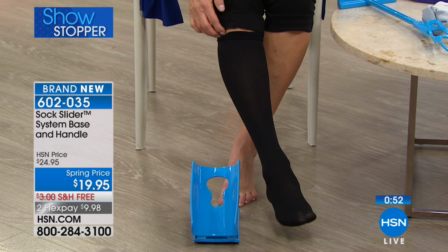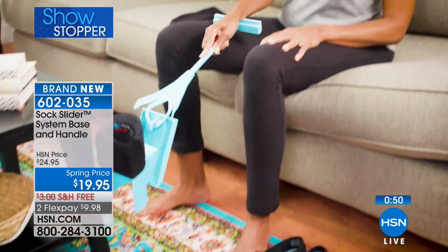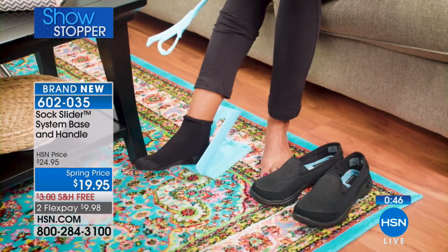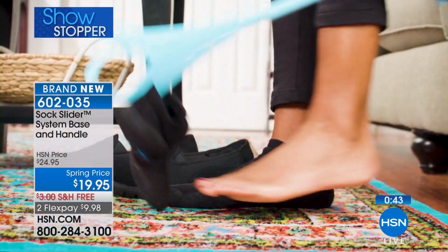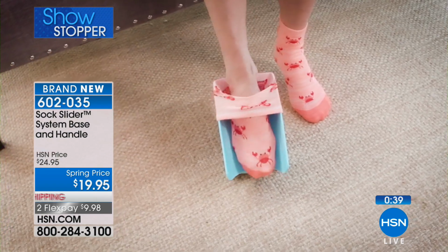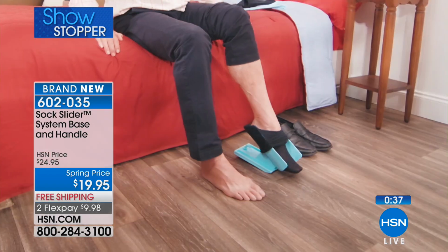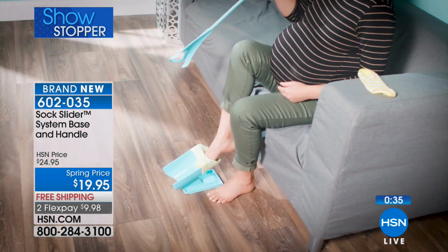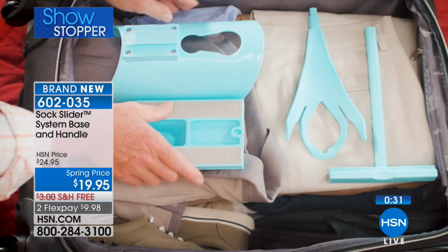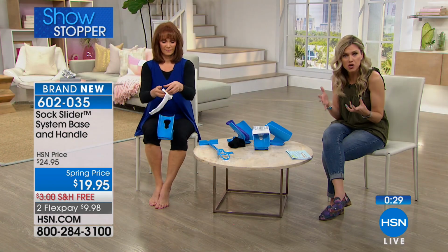But do remember, if you have the super duper compression socks, it'll get it on your foot, but getting it up is different, because you're really meant to massage up in that area. But this is what you'll use with your typical standard socks every day. That could be your nighttime fuzzy socks, your knee-high hosieries during the day, or your athletic low-profile socks. It doesn't matter what type of socks, as long as it's not that medical-grade compression.